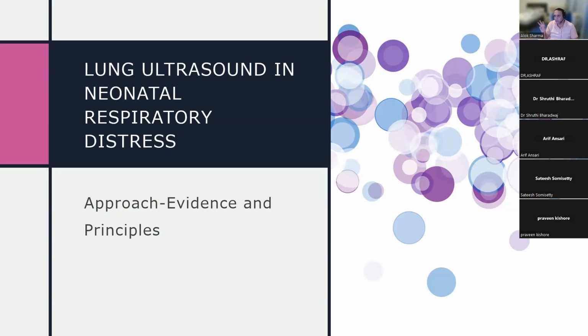Over the next week, I will be sharing with you 3 guidelines. One which basically allows you to implement lung ultrasound in your unit with the appropriate governance, a protocol which follows lung ultrasound implementation and scores in neonatal respiratory distress syndrome, and basically a flow chart which helps you differentiate morphologically on lung ultrasound the different lung ultrasound pathology.